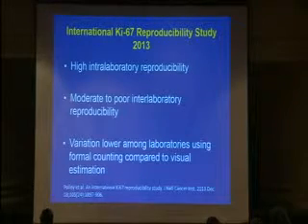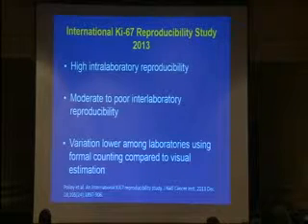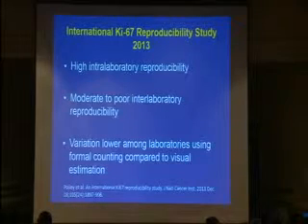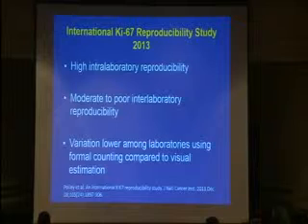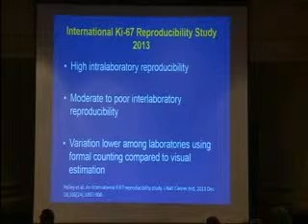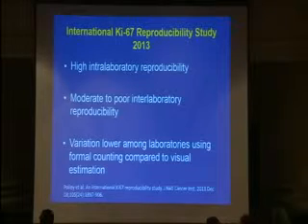I just wanted to talk about this interesting experiment where they selected 6 reference labs in the United States, and they sent them a pre-stained set of tumors stained with Ki67. And they asked them, okay, go ahead, take the sets, score them the way you do, and tell us your results. And in each lab, multiple pathologists read the slides.